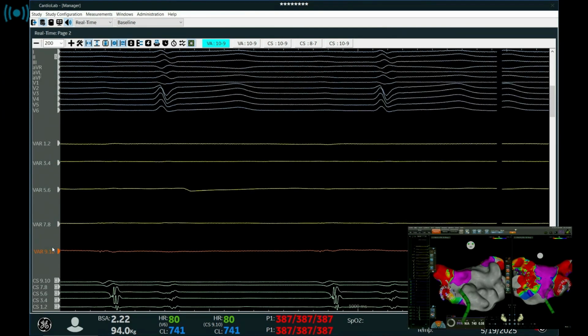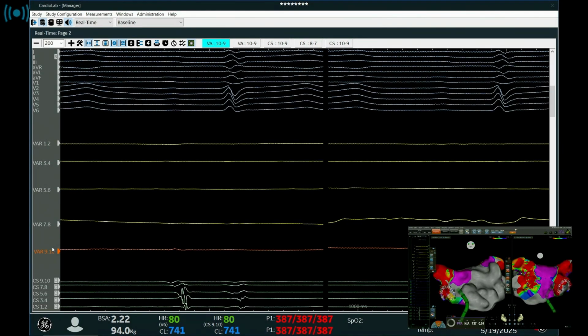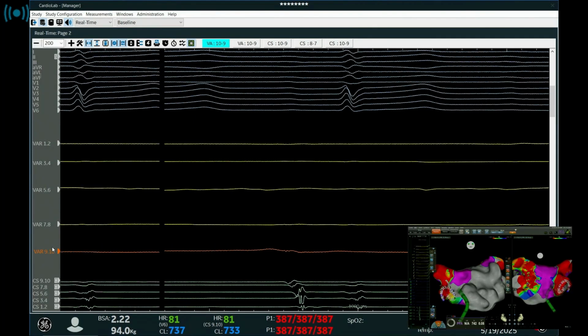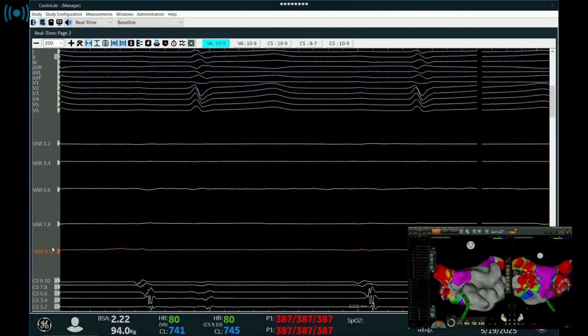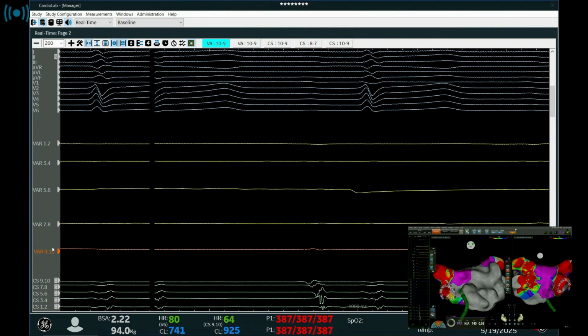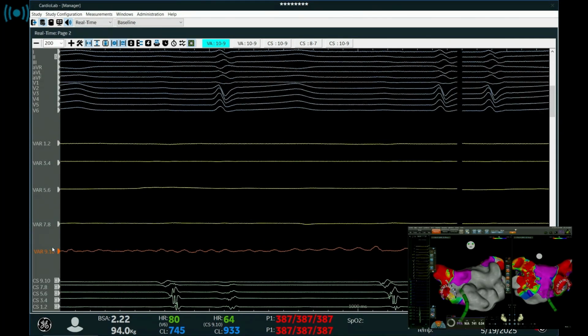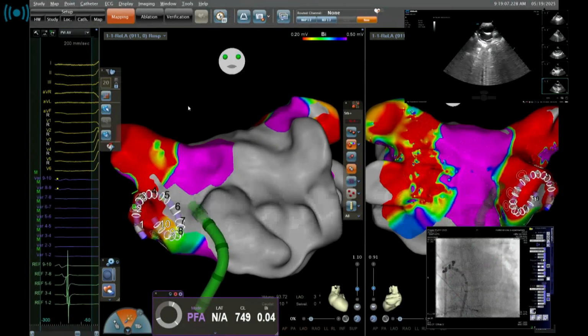Can I have a question? Yes, we have a really small area on the posterior wall. In this case, if you have a small atrium, do you prefer to continue with this posterior wall ablation, or is just okay? It's not the place for supraventricular tachycardia or atrial tachycardia from this area, the posterior wall? Okay. Thank you. Any questions from the floor? I prefer to avoid it because you can recover this area after. Okay, there's one question.